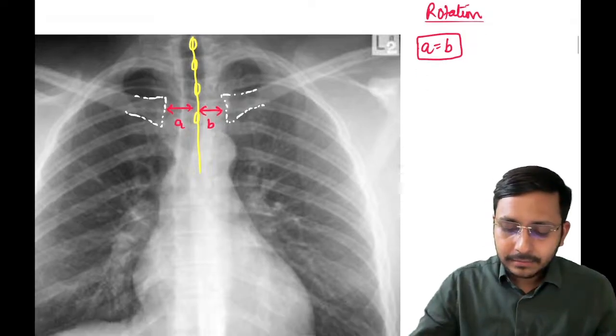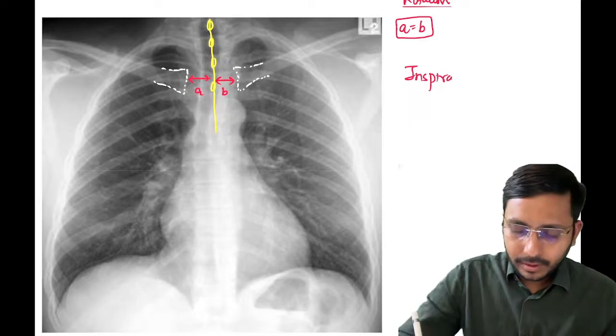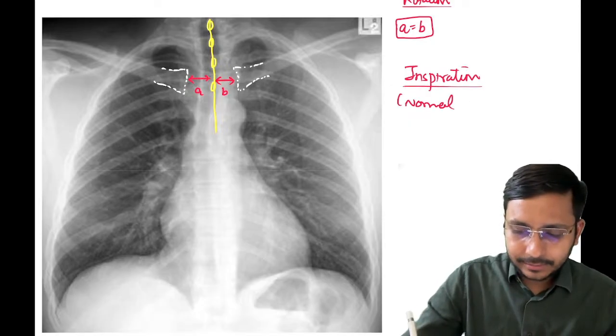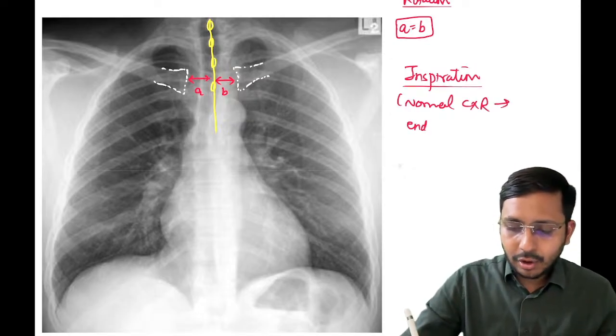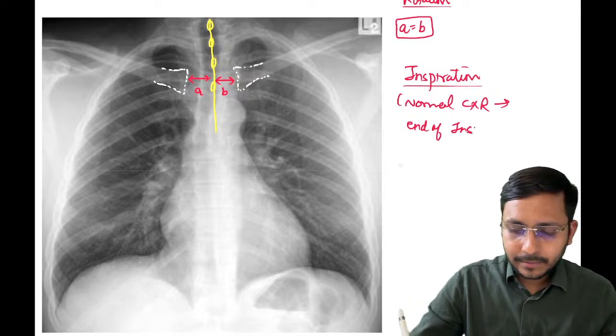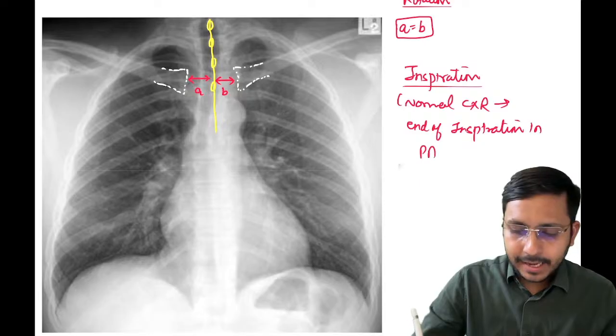Second was I, inspiration. Now a normal chest x-ray is taken at end of inspiration in PA view.